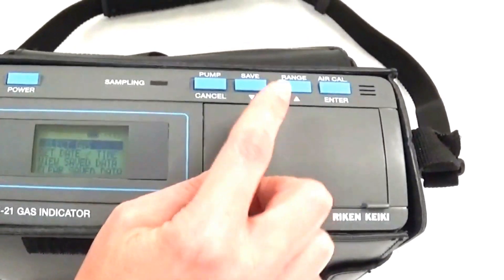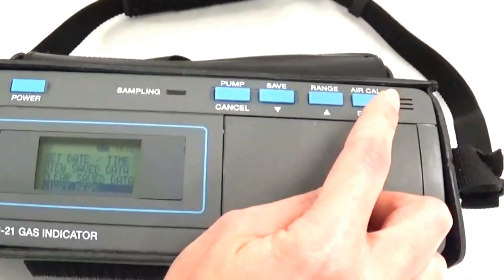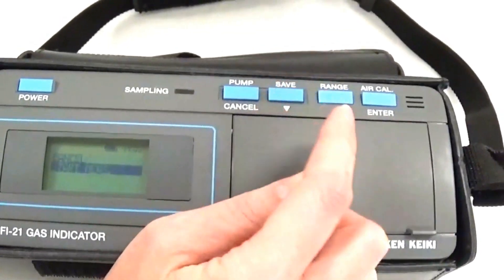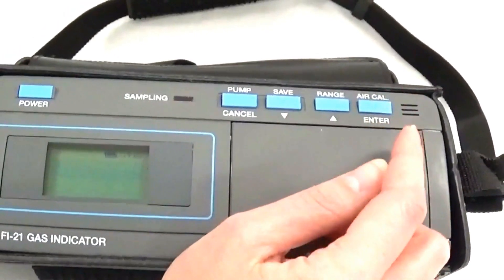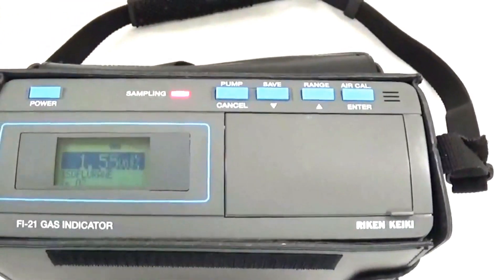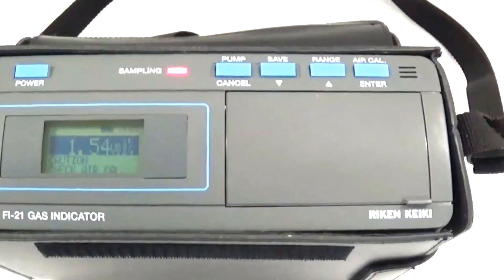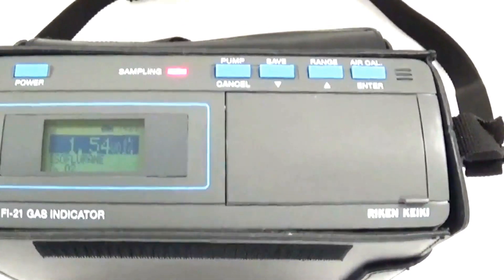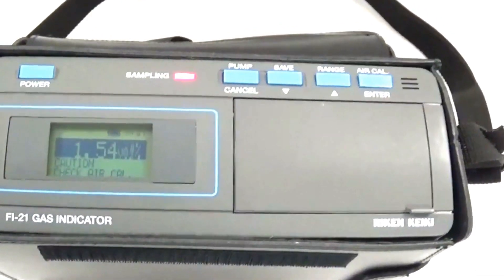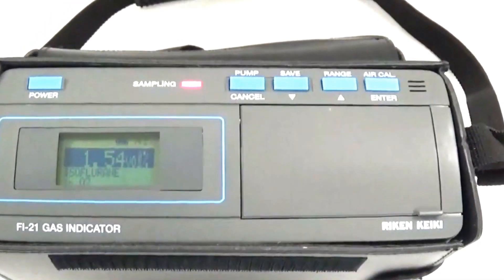Arrow down to Start Measure and select Enter. Arrow down to Start Measure again and select Enter. Now hit the Pump button to perform an Air Cal. The number has stabilized at 1.54, and it is critical to make sure the number has stopped and stabilized before ending the pump.